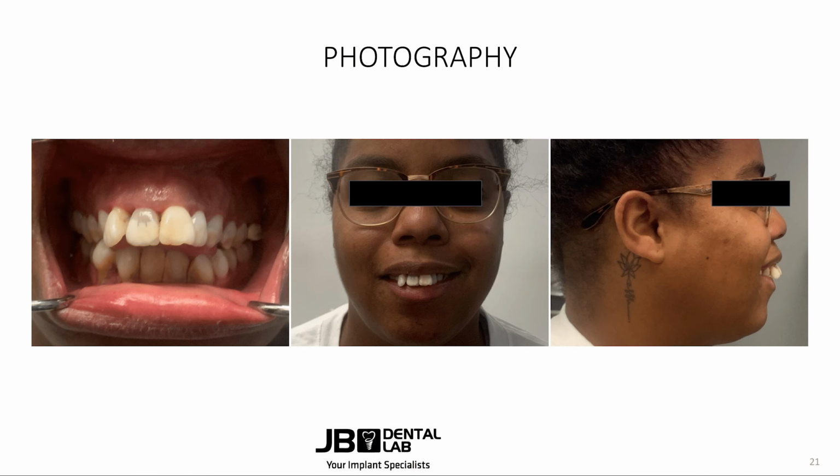Here are some examples of photos that we'll use to aid us in our design. Please note that the camera is at the same level as the patient's face. Also, it's important that we can see the patient's eyes and ears. So if the patient has long hair, make sure they tuck it back behind their ears.